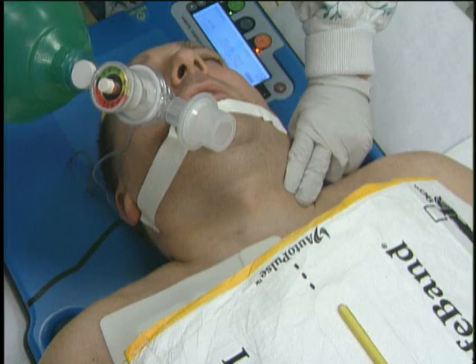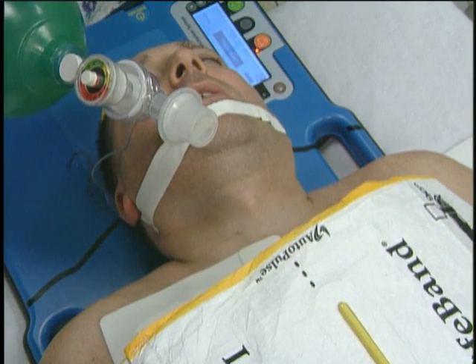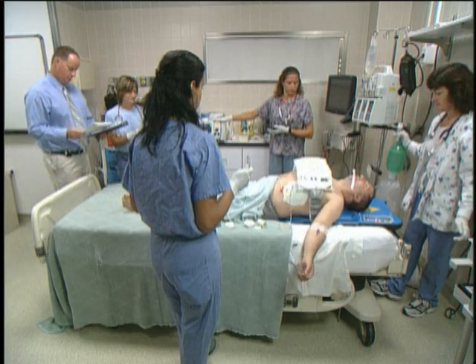Okay, let's pause the auto pulse and see what the underlying rhythm is. Okay, it looks like we're back in V-fib. Let's re-engage the auto pulse. Let's get ready to defibrillate at 200 joules. I'm going to hold the atropine — why don't you hold the atropine for now? Clear. All clear. Shock. If he stays in fib, I want to try amiodarone next.